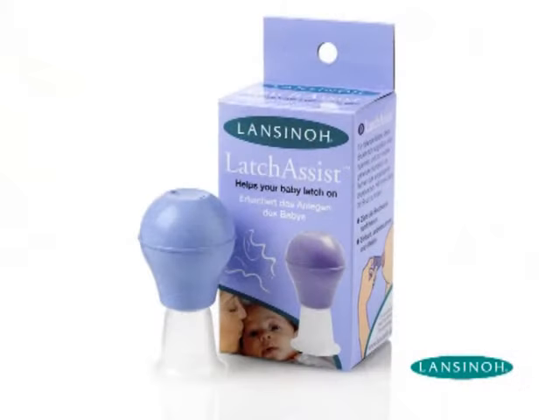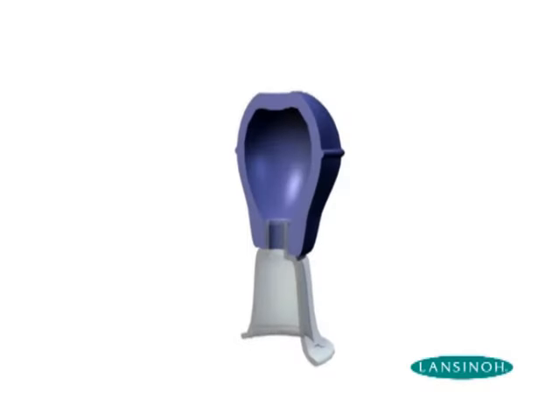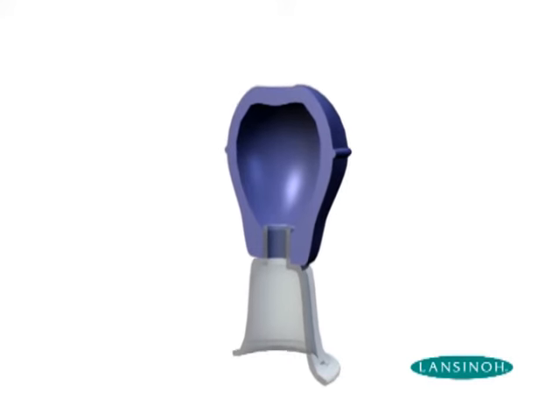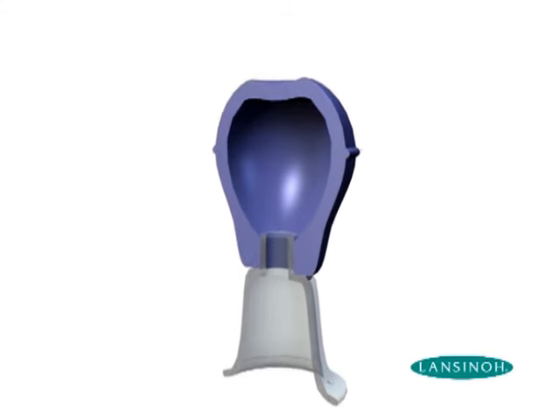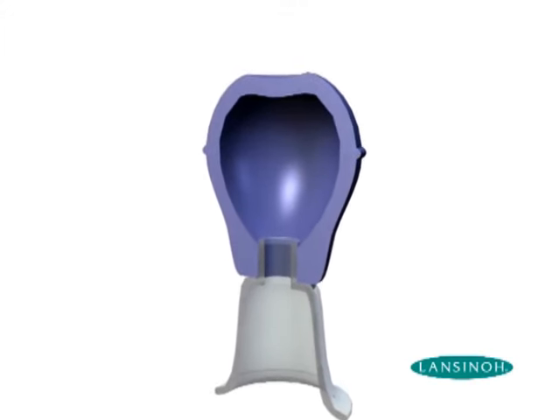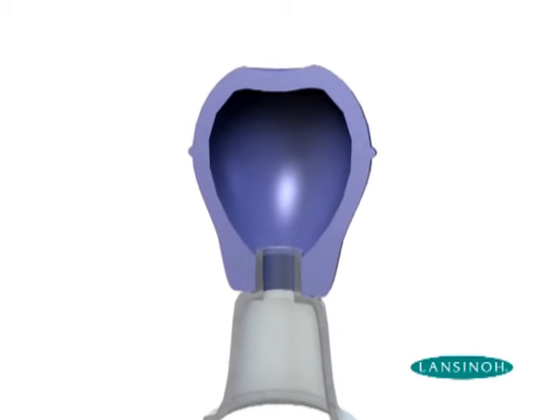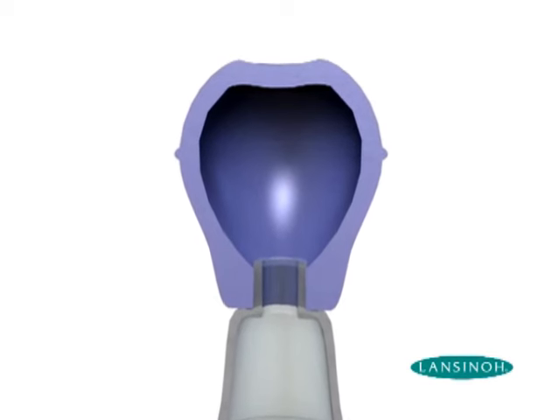The Latch Assist is a single user product designed for mothers to use on themselves. This will enable them to control the pressure and suction according to their own comfort. Designed with a smooth, rounded inner surface, milk will not stick to the inside of the bulb. The Latch Assist is not intended to be used to express or collect breast milk. If any breast milk is collected, it is important to discard the milk and wash the Latch Assist components.